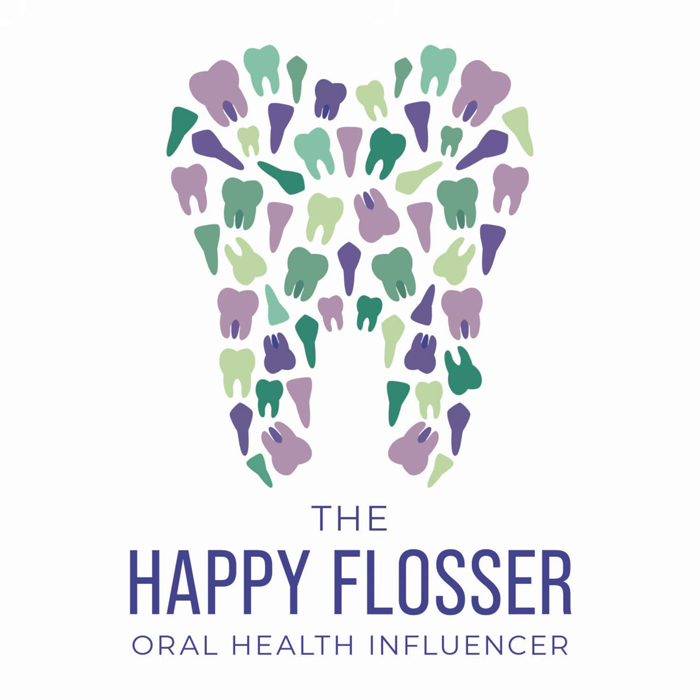The frequency in which we take radiographs is patient specific based on the patient's needs, and there are many factors involved, but most of our factors come from the questions that we ask, the ADA guidelines, the patient's level of risk, what they present with for findings, and their OHI.